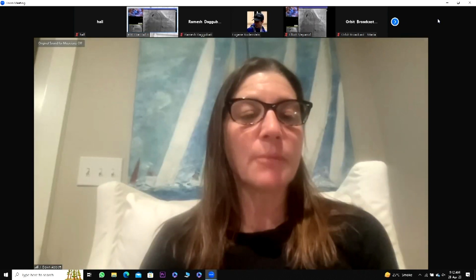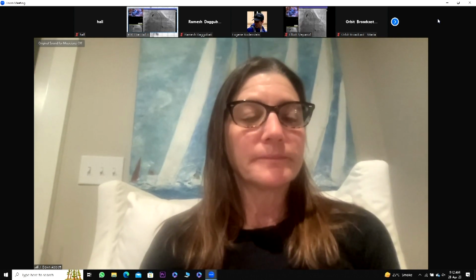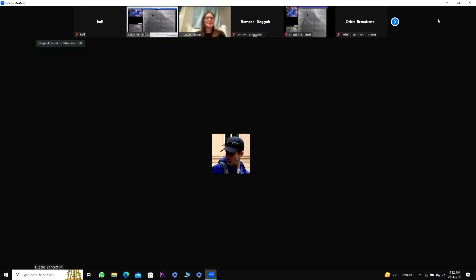Xavier, nice job with the sizing in the left main. I was just going to compliment Xiaoling Chen because I think he's made our job so much easier. I remember in the past when I used to spend a long time trying to wire the side branch and then try and find something that would cross it. Thank you, I think if you follow the technique well, it works quite predictably.